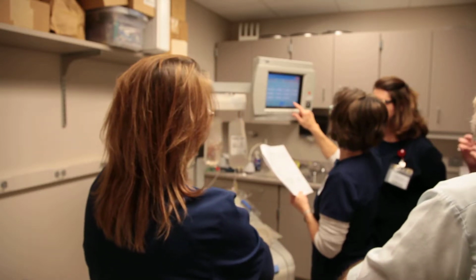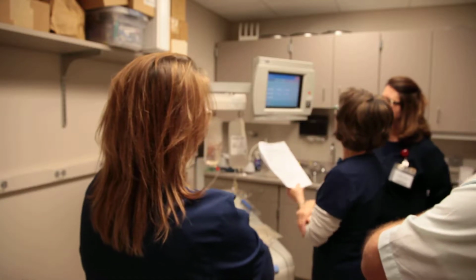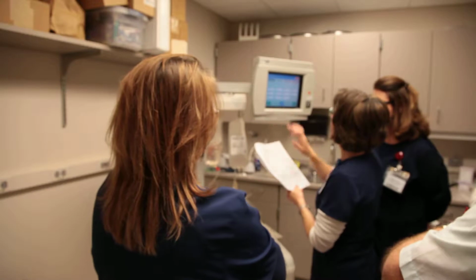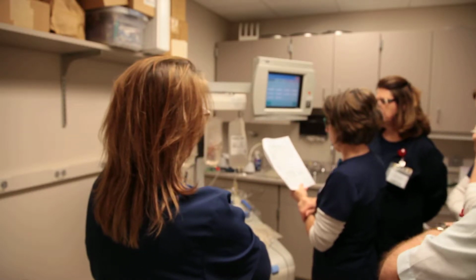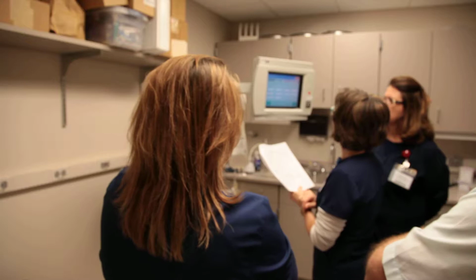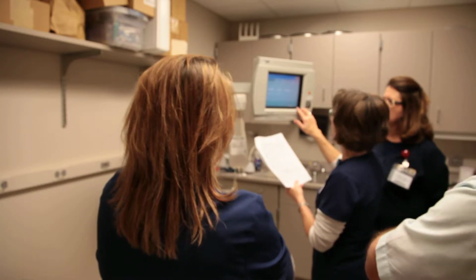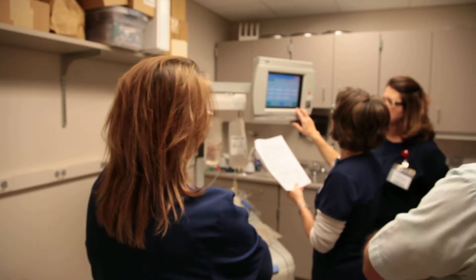We're going to leave that at 0 at the start of the procedure, and then we'll get into when we're going to change it. And then you need to go to the next page, because you need to change the RBC offset to 6. The reason I do that is 6 is a good setting anyway. If you are too dark, you'll need to drop it, but it most likely won't happen. And this way we're not wasting the whole first cycle to figure out that we have to go deeper.